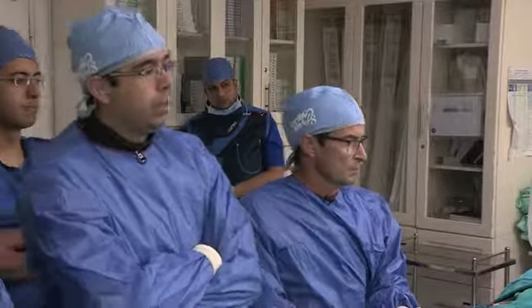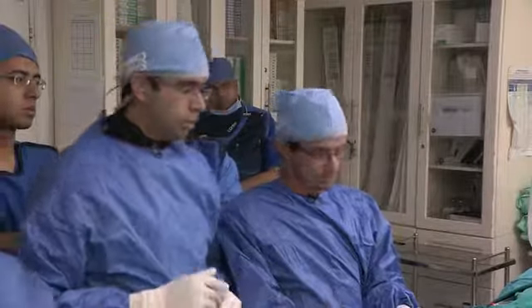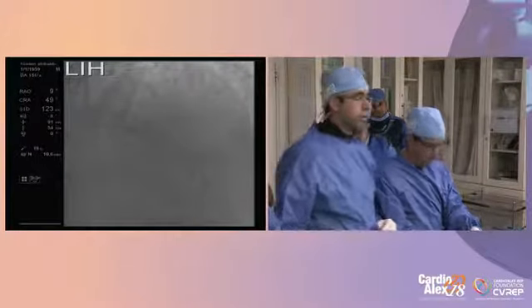Hello again, Dr. Sobhi. No, we are ready. We are ready now for the rotablation to do it live with you. Okay, let's start to do the ablation.